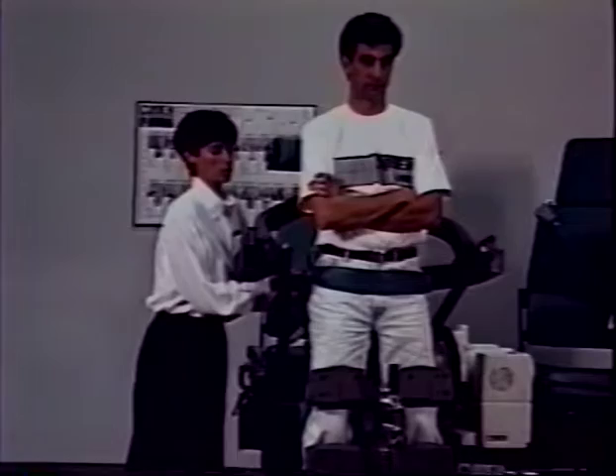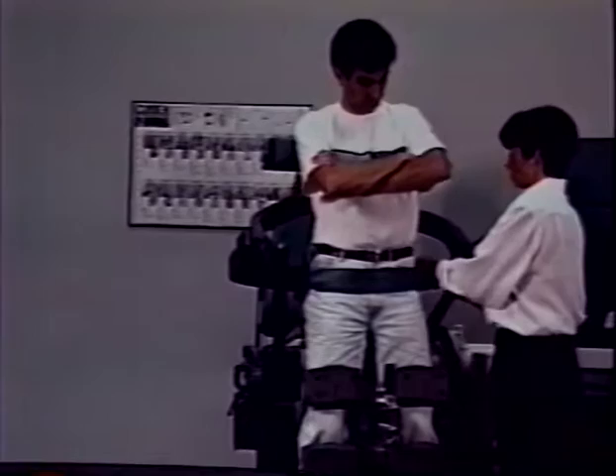As you move the seat forward, it will snug the pelvic belt. Following this, check to make sure the pelvic belt is completely snug.